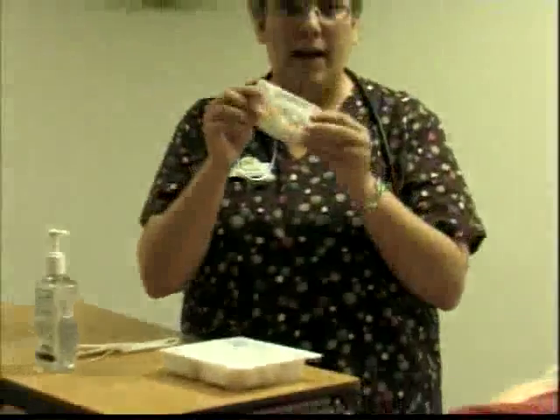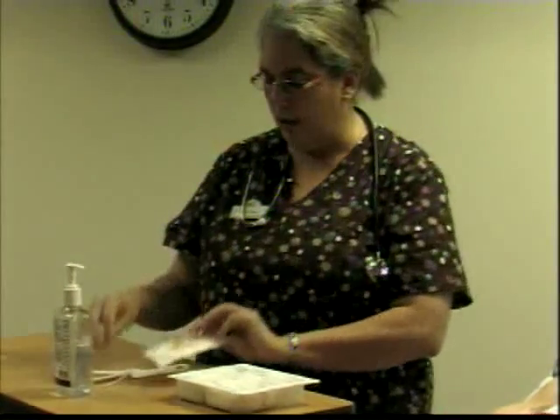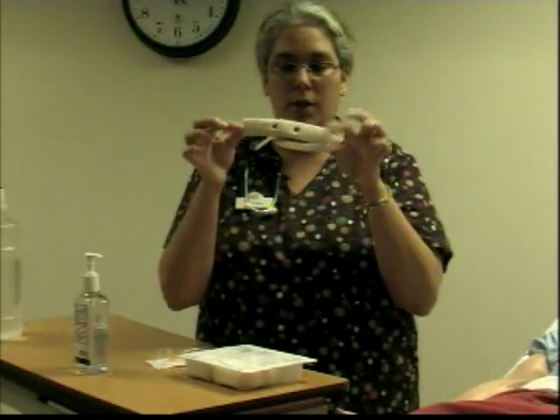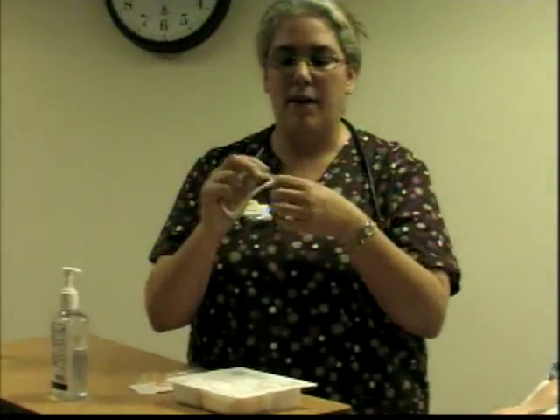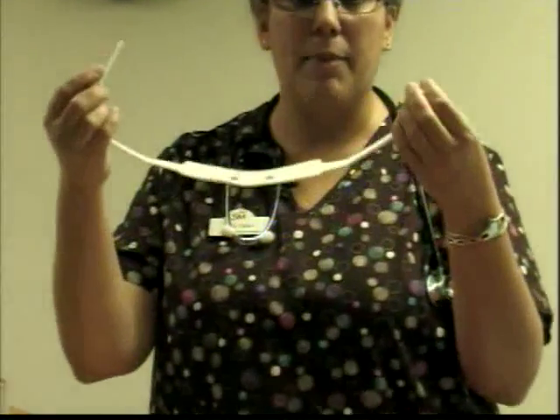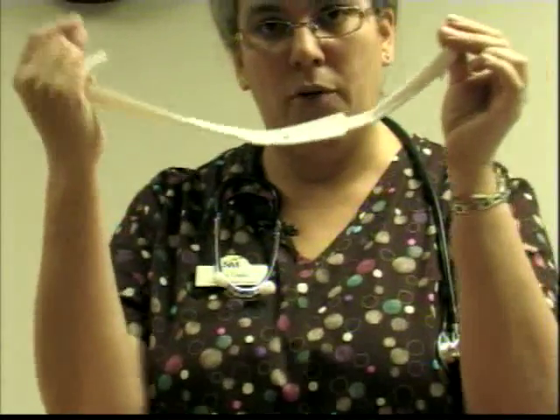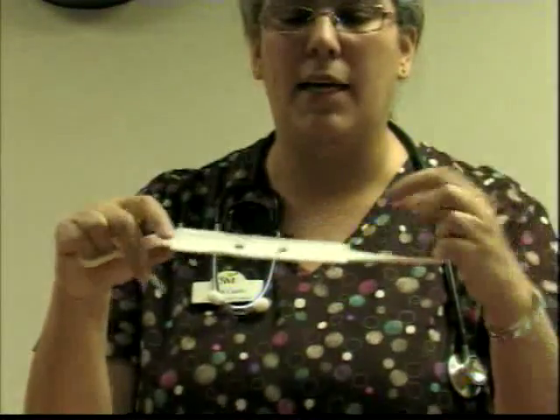Again, we mentioned having the inner cannula, the extra inner cannula, and then having your extra trach tube holder. This is one of the new inventions that really has created a lot of comfort for the client, because before we used straps, like long strips of material that you strap and tie on the side, and that was very uncomfortable for the client. Now with this one, they actually have some cushion in it, so it prevents skin breakdown.